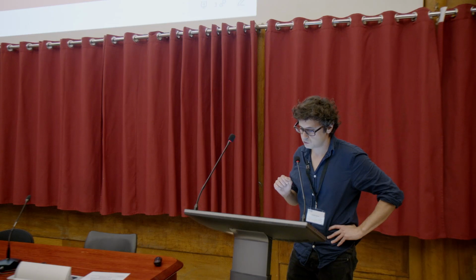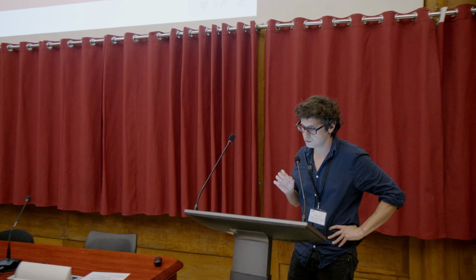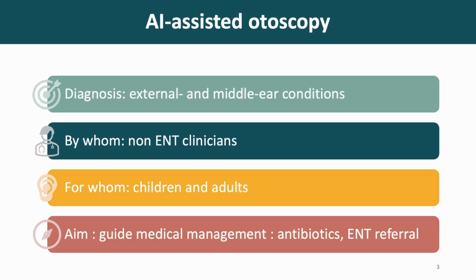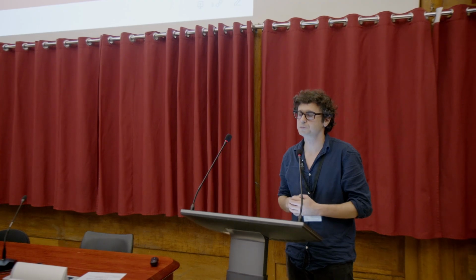So what we intended to do is to develop a system based on AI that could lead to improved diagnosis of external and middle ear conditions. The idea was to have a tool that could be used by non-ENT specialists, so GPs, for example, and used in children and in adults, with the aim of guiding medical management, for example, for prescribing antibiotics or referring to an ENT specialist.